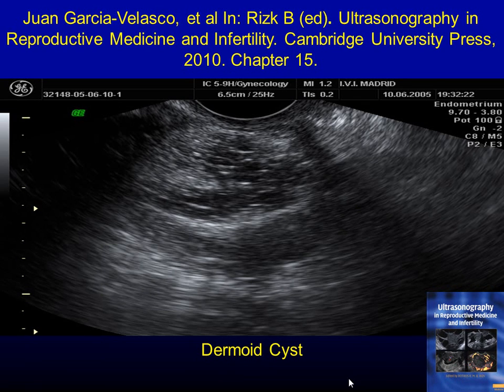Should I keep cutting? Because if you cut more, you know there is thermal energy, so you damage the eggs sitting there. Or stop. If you stop, most likely you will miss the dermoid. So you have to be relatively confident before going in that there is one to fish for. For example, if you cut from this end, you've almost cut through 2 centimeters of ovary before you reach the dermoid. The rest of the classic appearance of the dermoid is the hair and the sebaceous material, and sometimes many of the other things that you read about, like teeth or thyroid or GI tissue, which are all pretty common.